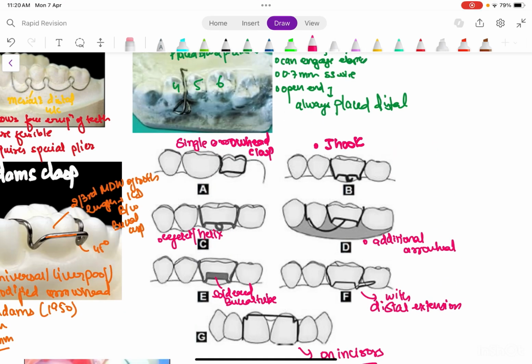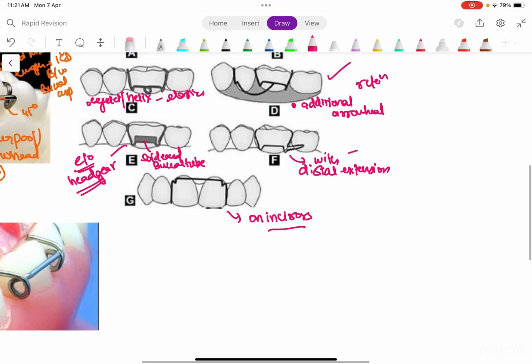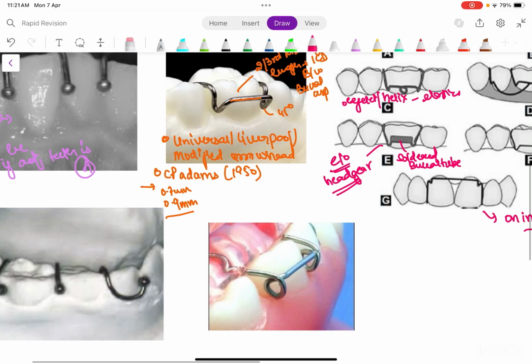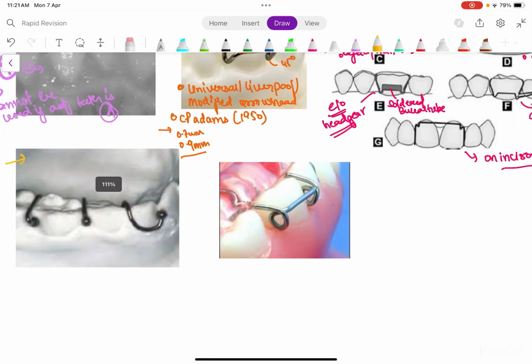Now see, single arrowhead clasp can be given in partially erupted teeth. J hook is for elastics. Helix is also for elastics. Additional arrowhead is for additional retention. Solder tube is for extraoral use, when you have to attach the headgear. Then distal extension is for more retention. Also you can add elastic. Then on incisors.